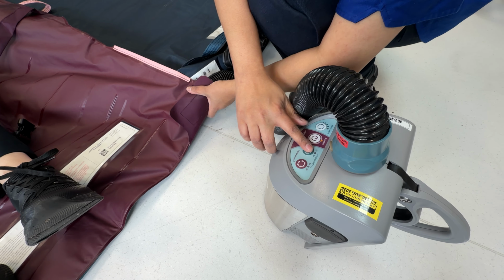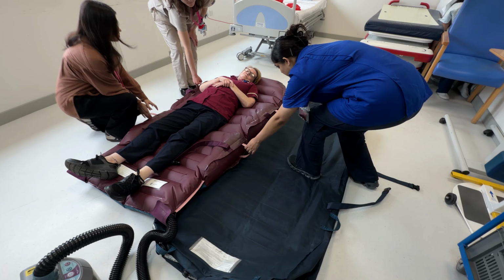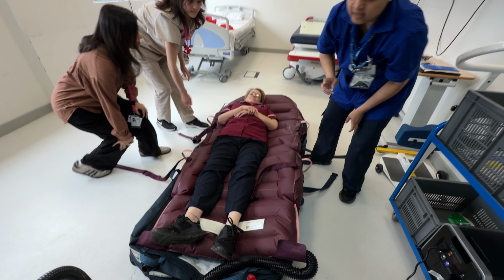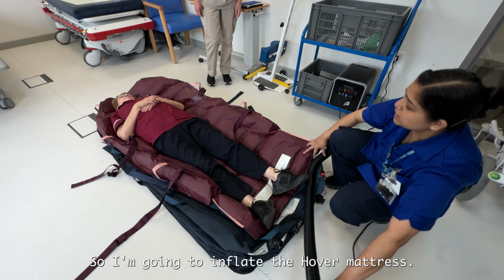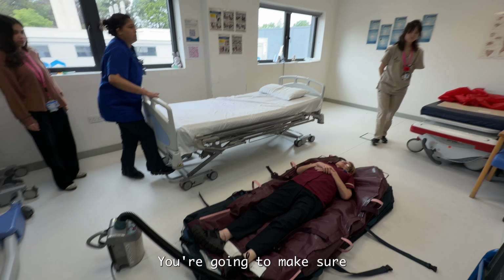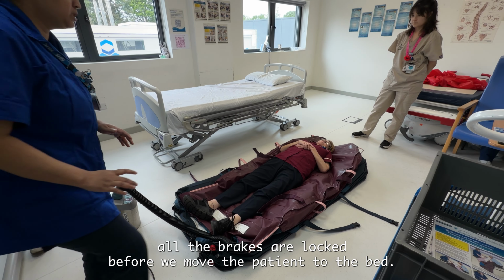You ready? Are you feeling okay, Sharon? Yes. So I'm going to inflate the hover mattress, but before that I'm going to get the bed next to you. You're going to make sure all the brakes are locked before we move the patient to the bed.